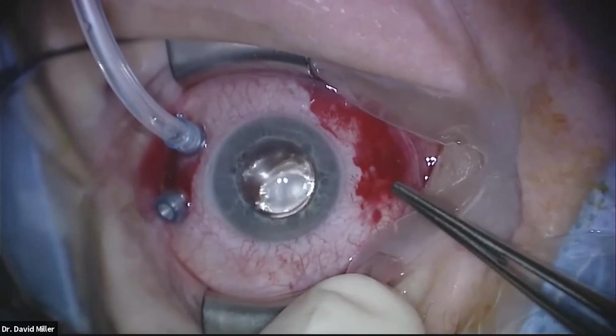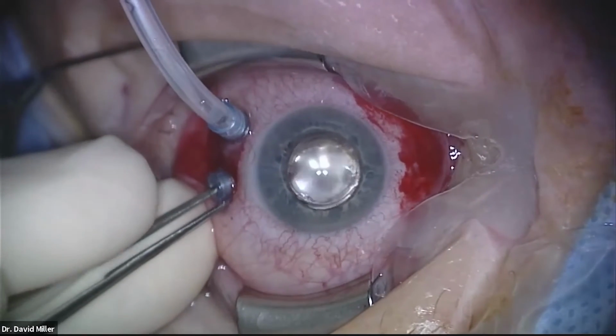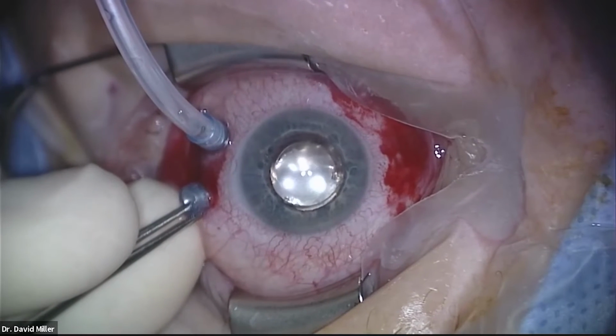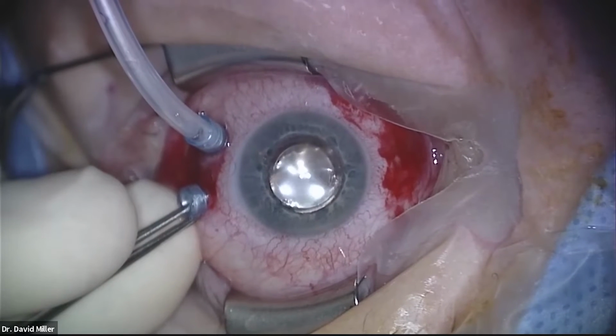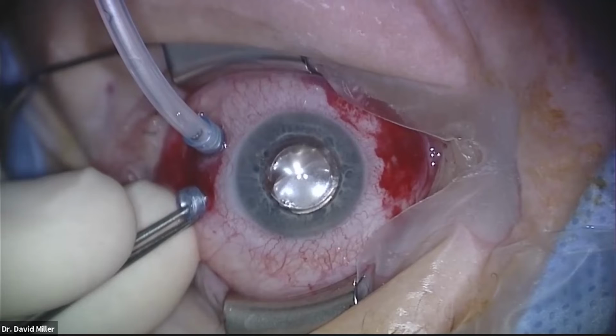And that kind of works. See, the gas stopped. Then we're going to vent through this side as Mike pumps in the new gas, displacing the air from inside the eye.